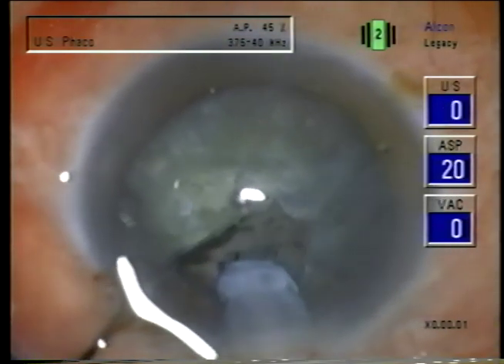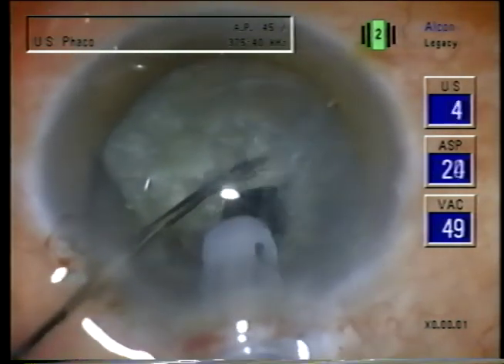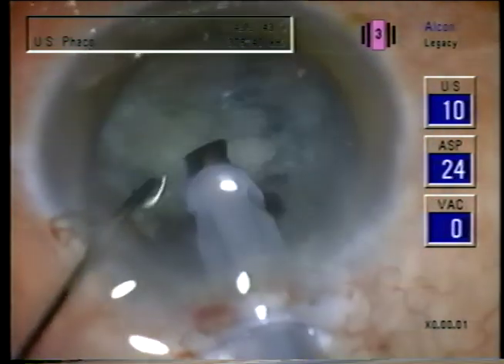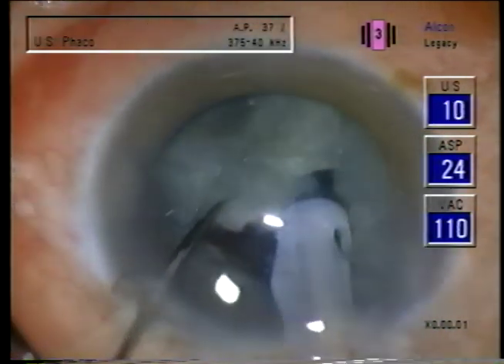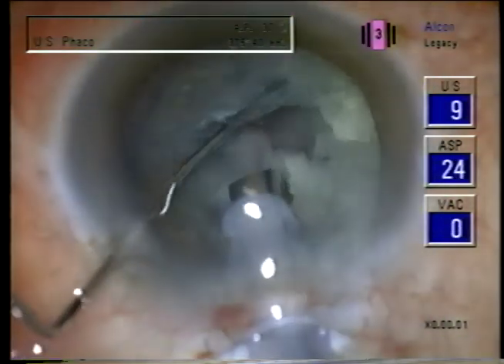And now I will do the horizontal fracture. There's a fracture through that and now I can separate off little sections. One can either emulsify those as they're fractured or do all the fracturing. So we have the entire inferior half fractured.